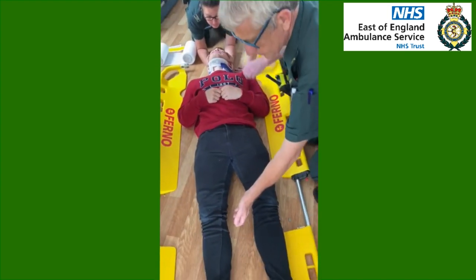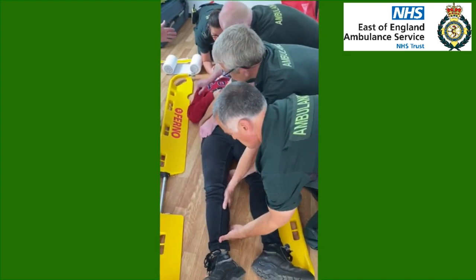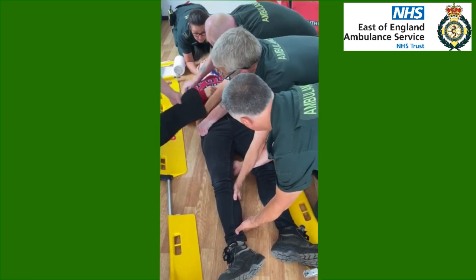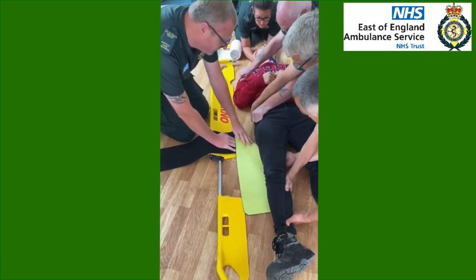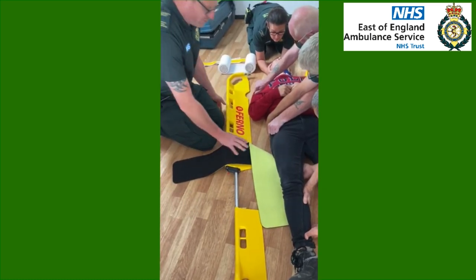If we could go for the three under, three over method please. That's going to be on Sarah's command, on ready, set, move. What I'm going to do is get the pelvic binder — black side up — and I'm going to point it into a triangle pointing down towards the feet.